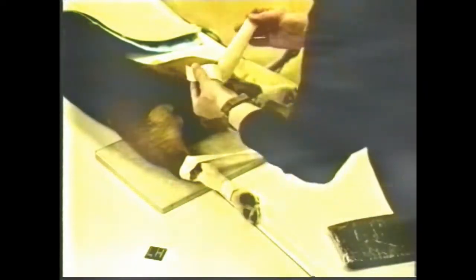Tape is placed on the leg so that the leg can be extended. Tape is also around the hock, which provides a rotation correction for accurate viewing of the stifle. The tail is taped out of the way so it does not interfere.